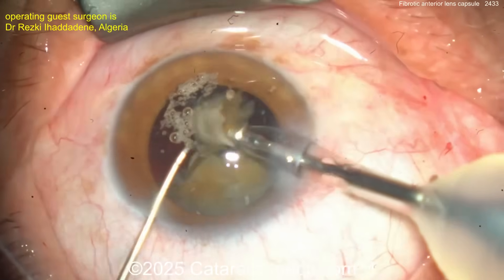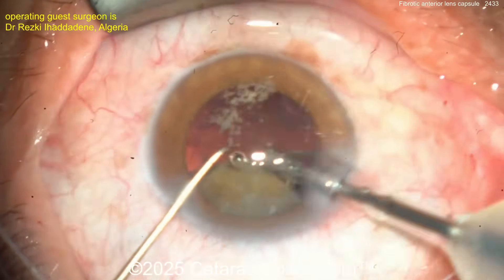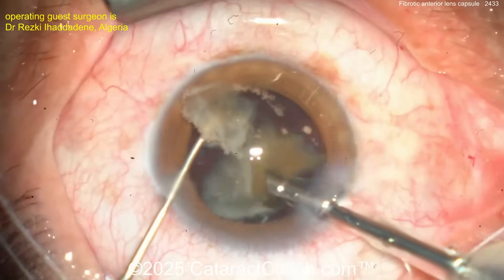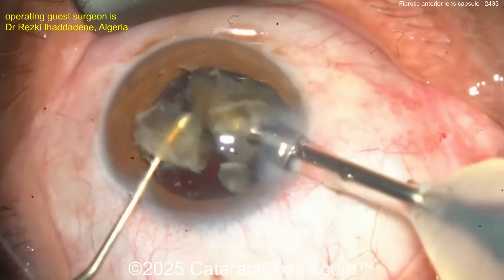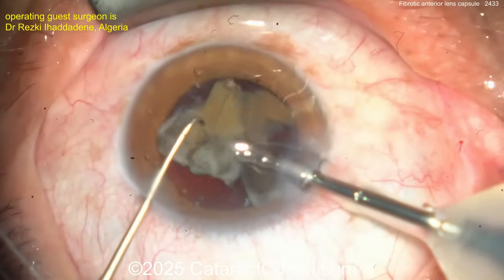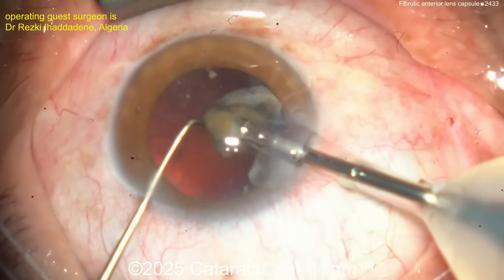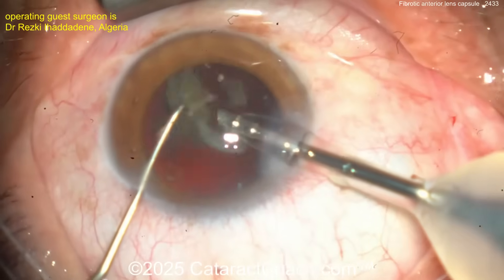Now you've got one quadrant left in the bag. Remember the bag is empty other than that quadrant — no cortex, no epinuclear shell, nothing weighing it down. When this last piece comes up, be careful — the bag can be floppy. Keep the chopper in what I call the safe position: smooth back end towards the posterior capsule, just to prevent the capsule from coming up.